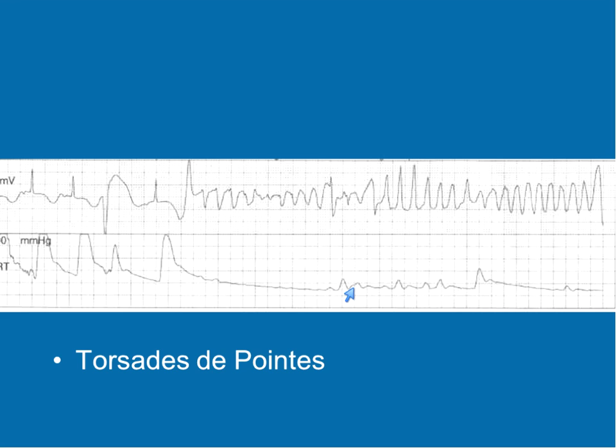And you can see here, there's no blood pressure to speak of. I mean, okay, so the heart was able to push out a little bit of blood here, but this is not a blood pressure to speak of. I can't see the scale, so I can't tell you what that is. But if we just consider that this might be 80 and this is 120, you can see that there's just not much happening here in the movement of blood.